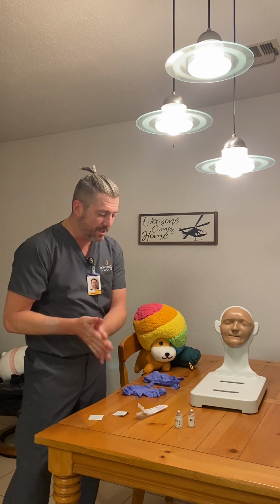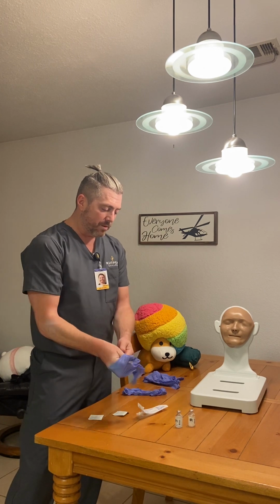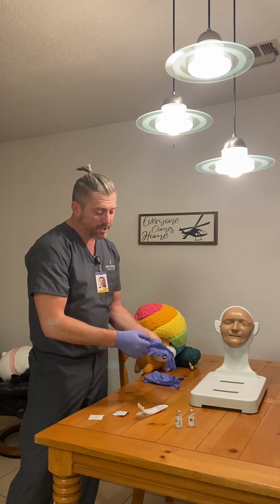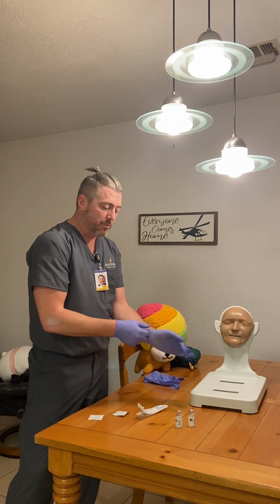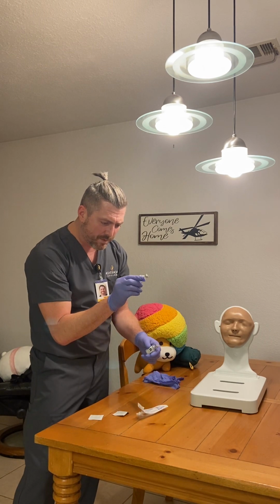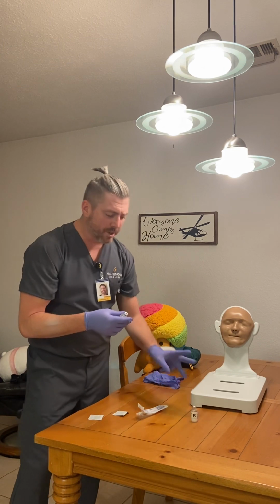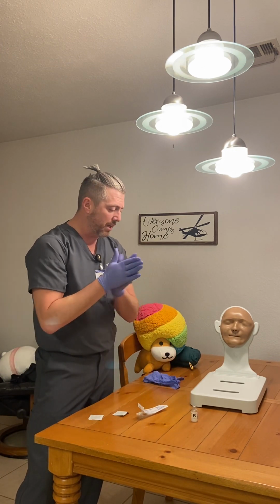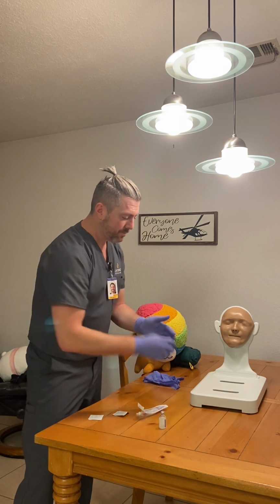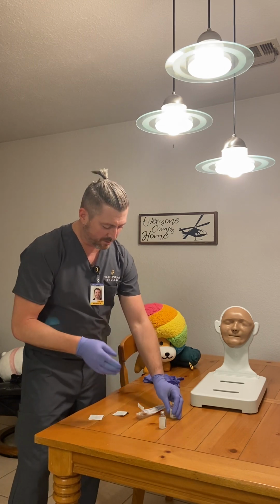So perform hand hygiene again. I'll put my gloves on. These vials, I would be taking them into the patient's room. If they're refrigerated, I would let them come to room temperature. I'm going to check the expiration date for both of them. Expiration is good. Also look for any sediment or cloudiness. I'm going to roll them in my hands. Put them on the table.